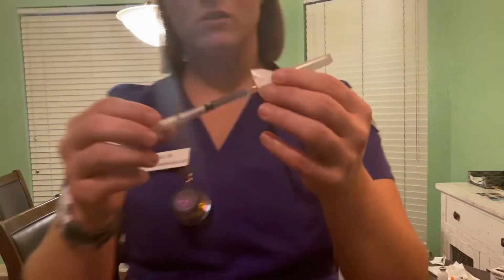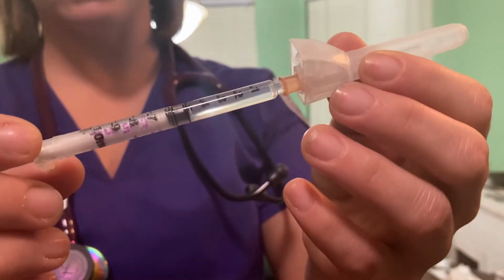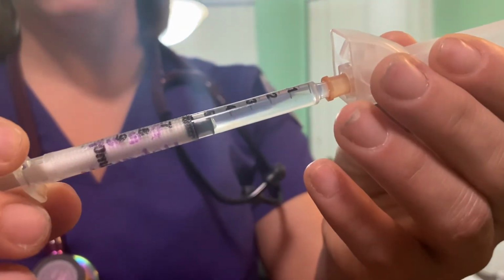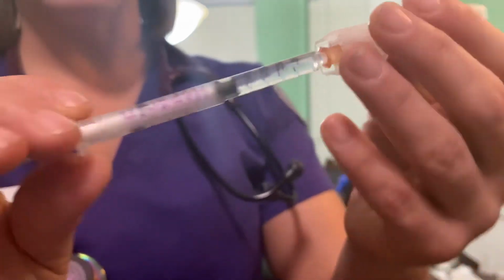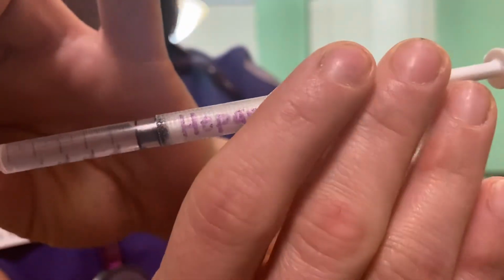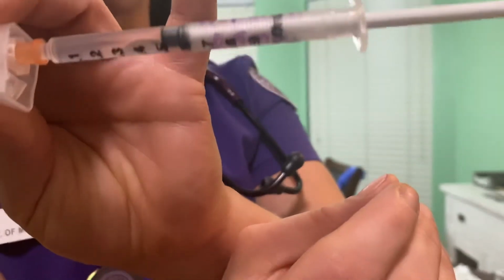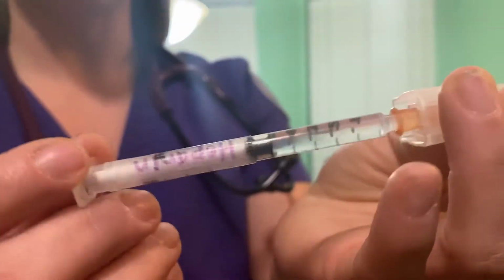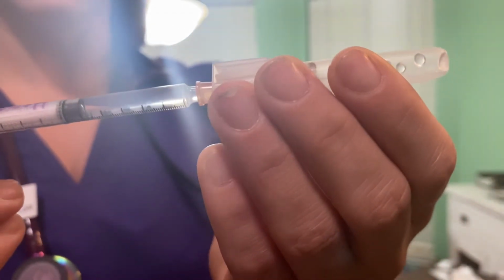You can see there's no bubbles or anything. It is at the 0.5. I am using a 1 mL syringe. It's labeled heparin, and then it has the 0.5 mLs, and it's going to be a 25 gauge needle that is 5/8 inch long for the subcutaneous injection.